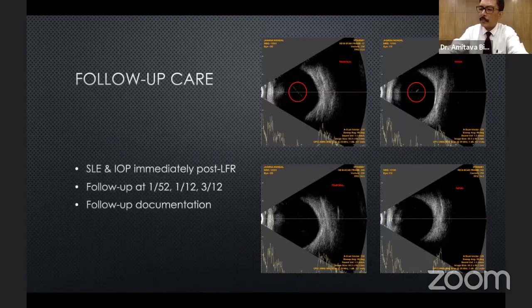There was a question from Dr. Dinesh Rungta about post-laser advice. What do I do? I don't give anything special, no drops or anything, or no special instructions. The patient before the laser had the floater, and after the laser immediately does not have the floater. The only thing that I do is I check the intraocular pressure. I usually call the patient at 1 week, 1 month, and 3 months and record the pressure and other examination routinely. What do you do, Dr. Paul Singh, for the post-laser advice?